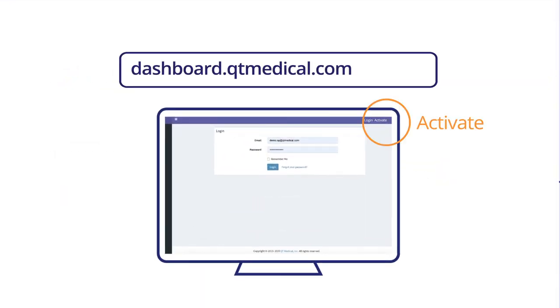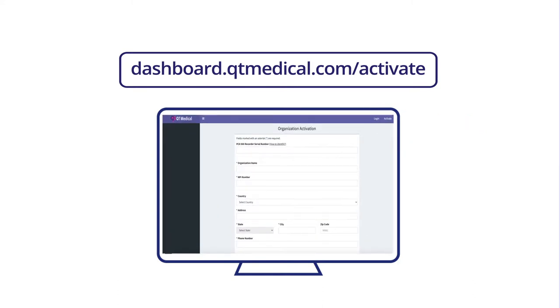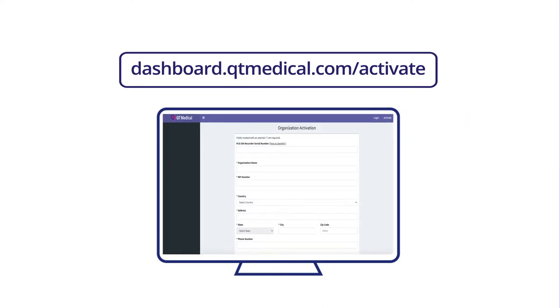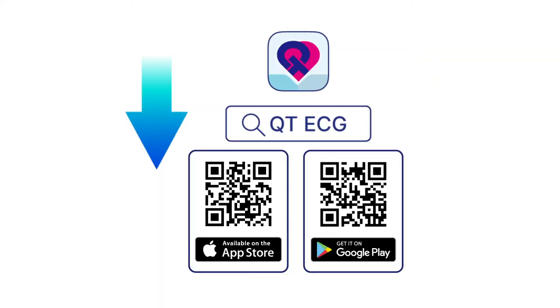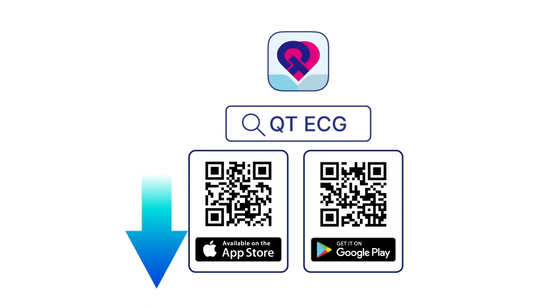You must first go to dashboard.qtmedical.com slash activate to create your username and password. Then download the QT ECG app.